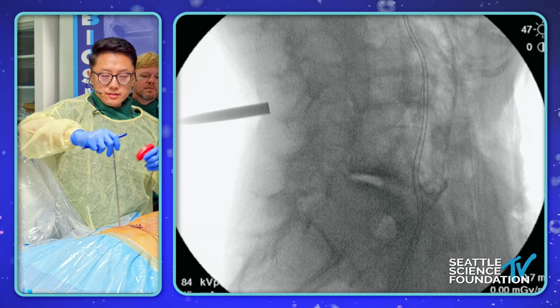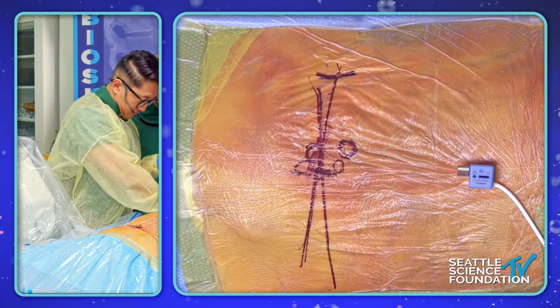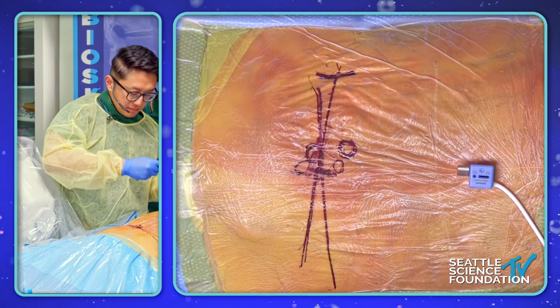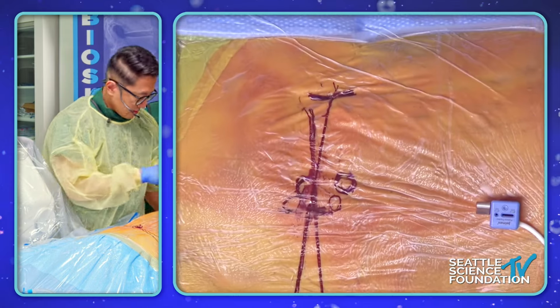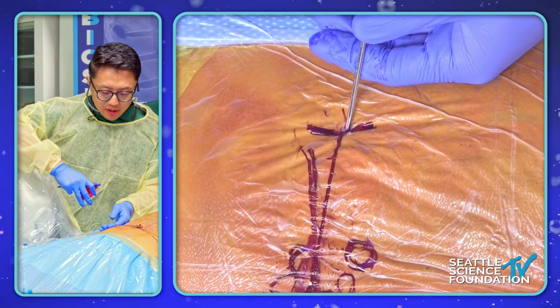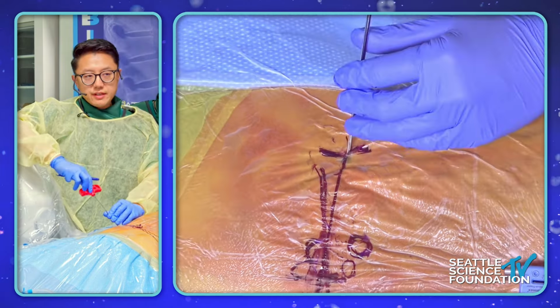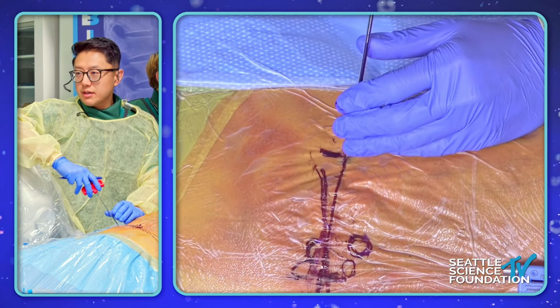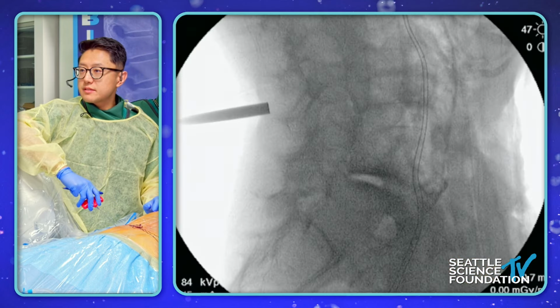Okay, so again, the plane of the spinous process is right here. Just based on that, that's where my starting point is going to be. So we'll make a little incision here. And then there's a couple ways you can target. You can target on AP, you can target on lateral. This particular approach is the trans-SAP approach. So I know I'm docking on bone, so I typically actually do this on the lateral instead of the AP. Let's take a shot there.